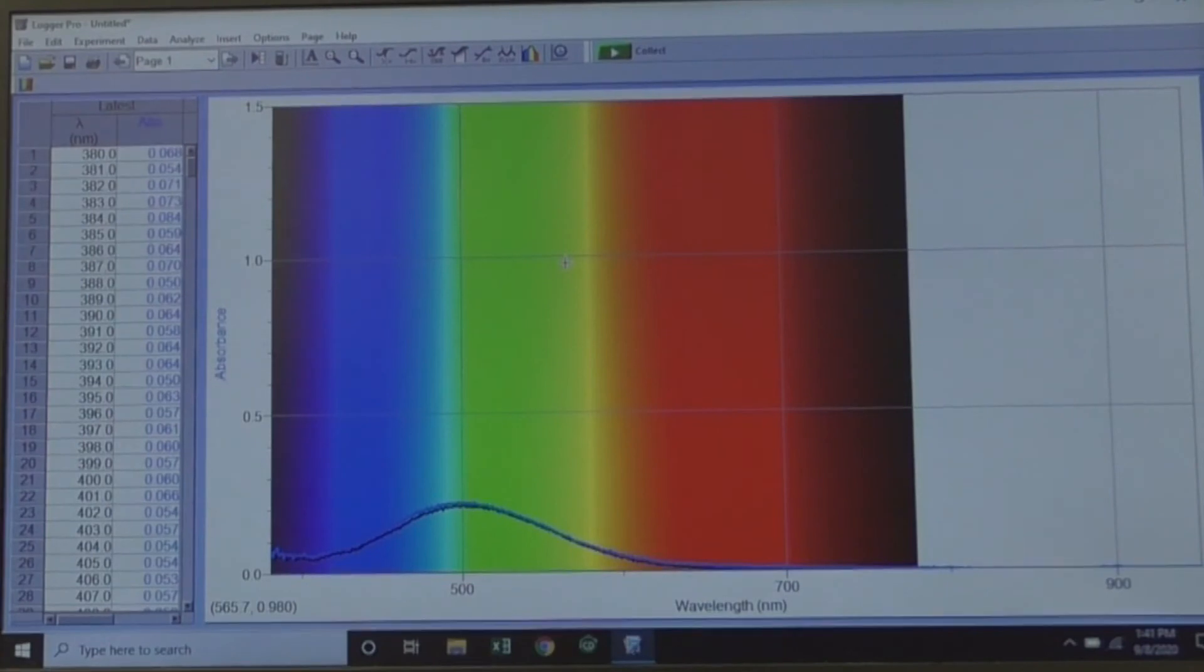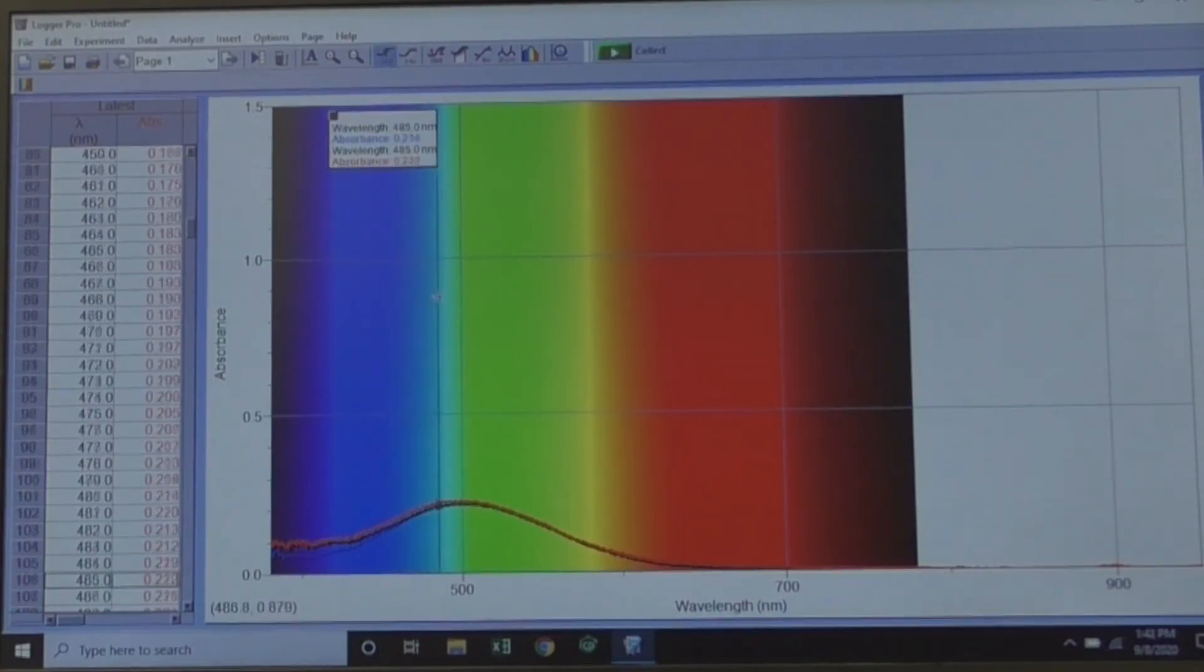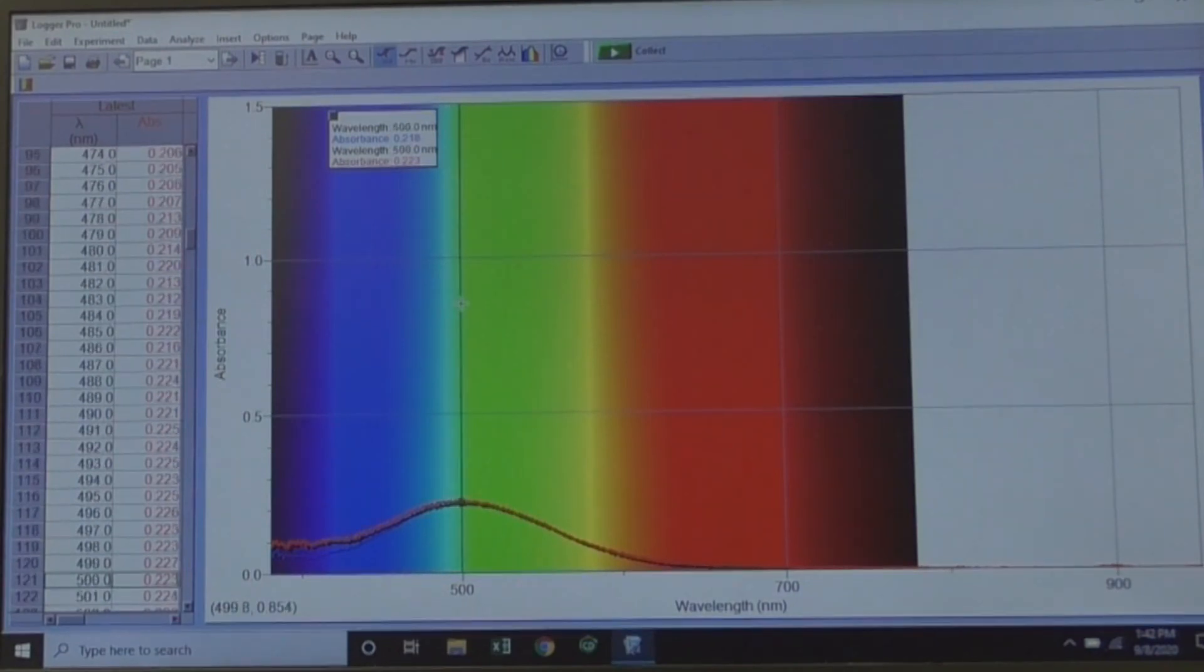Use the examine tool to read your results at 500 nanometers. In this example, the patient's result is virtually equal to the standard. Notice that the data is color coded. Here, the standard data is blue and the patient data is red.